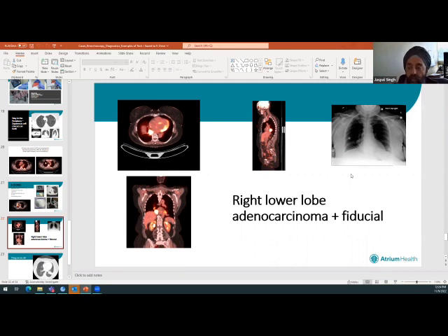So I biopsied her, sent the little preliminary specimen, and the pathologist said, yep, we got plenty. I left a few of what we call fiducial markers around, and she's going to go for advanced radiation therapy while the pathology is pending for immunotesting, to see, as we discussed as a team with the oncologists and everybody else, how best to treat her based on her immunoprofile.